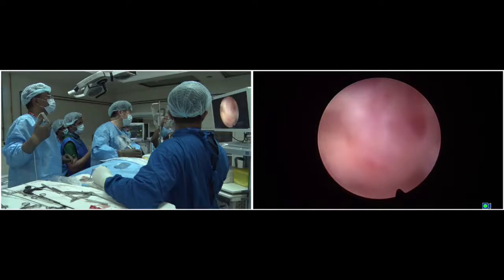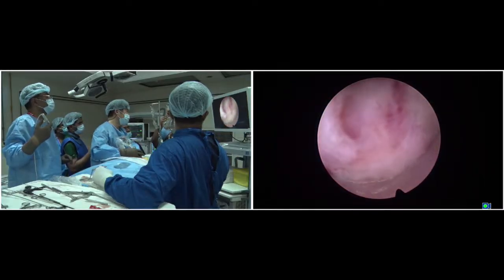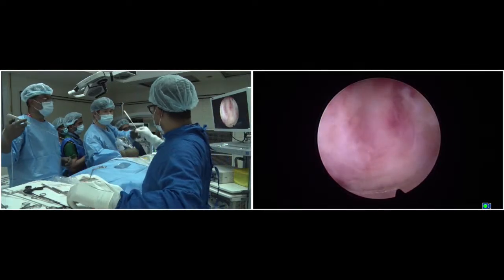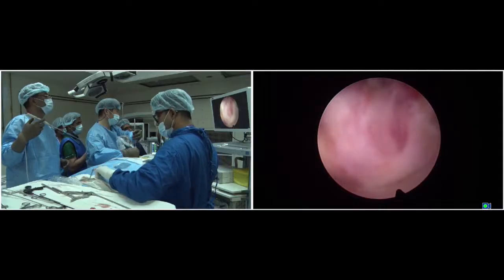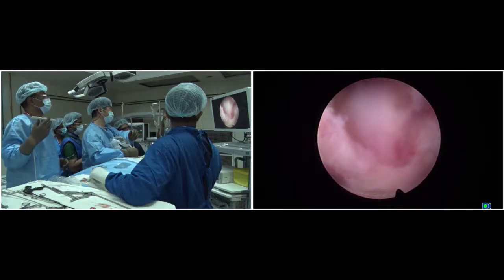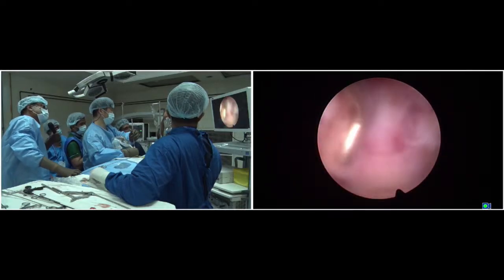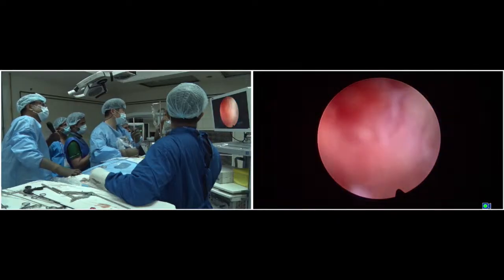This is foraminal ligament. This is not nerve. This nerve is here. Probe. I will show that. Here is a foraminal ligament. Nerve is here. This is the nerve. Okay. You can see the nerve, dear audience. Yes. And the root is located here.